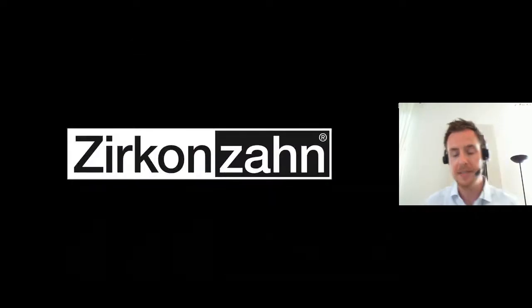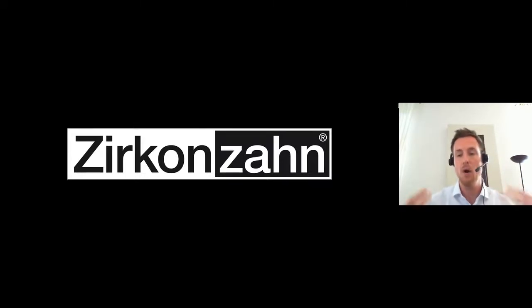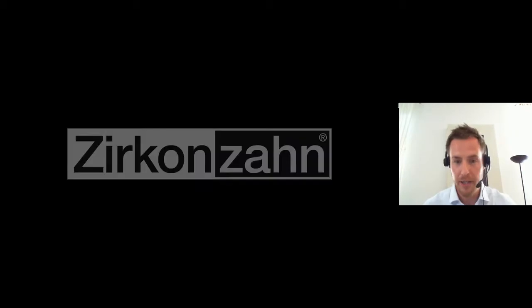Well, this is the whole digital workflow from Zirkonzahn. Obviously, this is just an overview. There's a lot more things to explain. I can talk like 8 hours in a row about that. It's very interesting. Yeah, I hope you enjoyed this webinar.